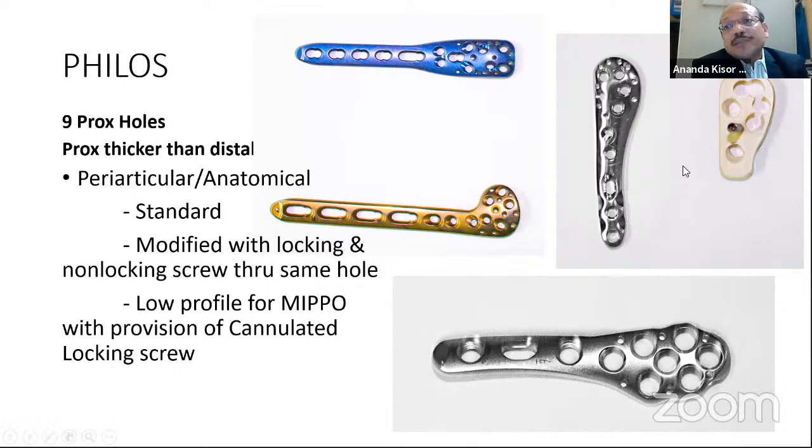So there can be exact placement, and also you have to measure the screw, exact measurement of the screw inside the humeral head, which is mandatory, because in these cases the screw should not pierce the articular surface. Otherwise, that will lead to significant damage of the articular cartilage. And there is a measuring gauge that is usually used for this. That I will show you how it is used. So this is the low profile proximal humeral interlocking system plate for the cannulated locking screws.